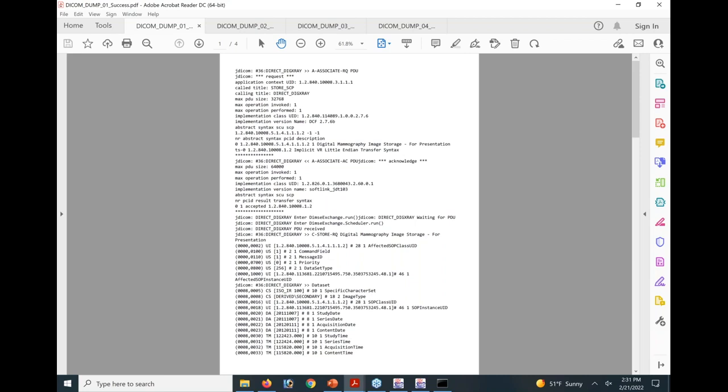Go to page 25 here, guys. Ooh, we're almost done. Take the pencil or the highlighter or your pen and circle where PDU 1 begins on page 25. That'd be a pretty easy one. First line. See where it says PDU type 1? And then right below it says association request. So maybe just circle association request for PDU 1, so you kind of recognize that PDU 1.